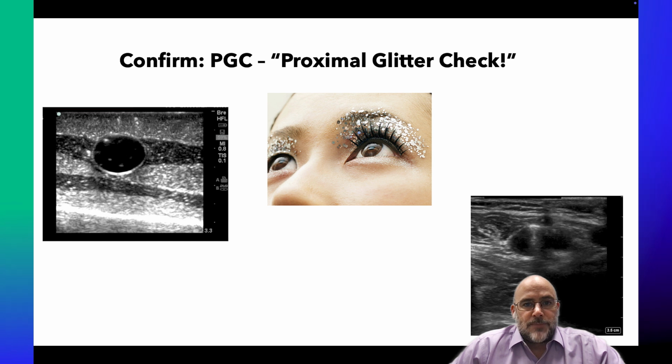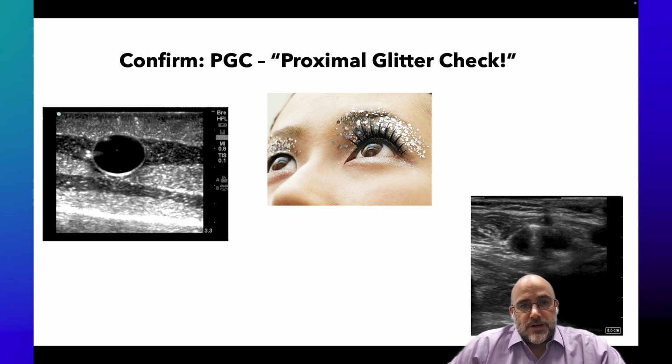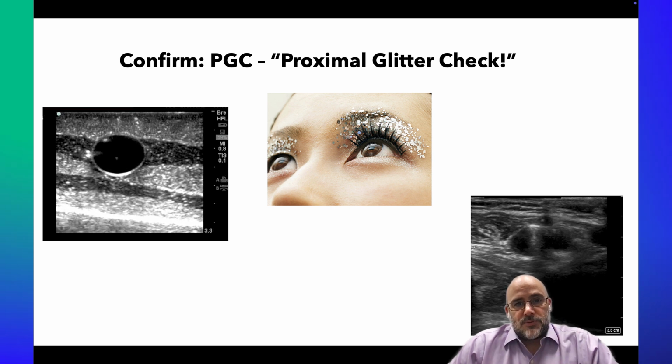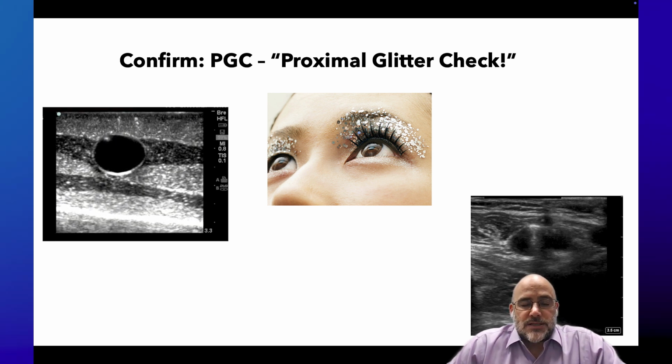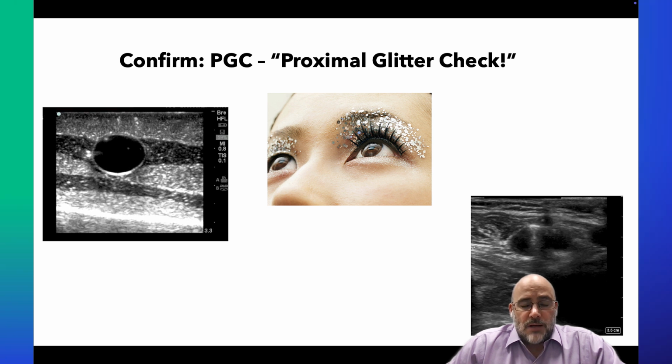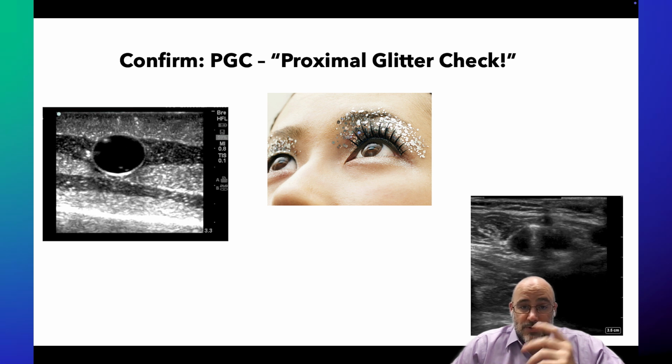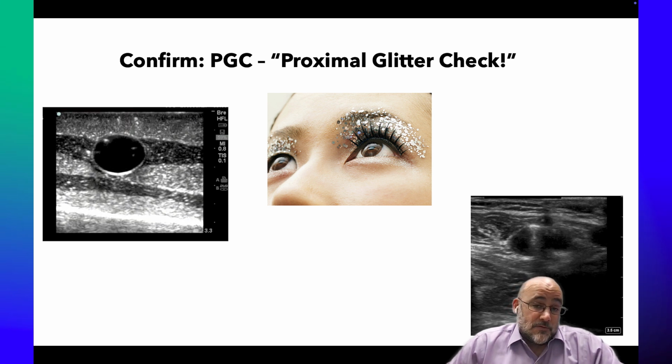And why is that important? It's important because not infrequently we'll get good blood flow initially when we're putting these deep catheters in. And then we'll be able to push fluid through and we'll say, all right, well, it flows nicely. But the problem is, because these vessels are deeper, we don't have that tactile feedback of the vein blowing. We can't see it swell up, and we can't see it rise to the surface. And it's not as painful, quite honestly.